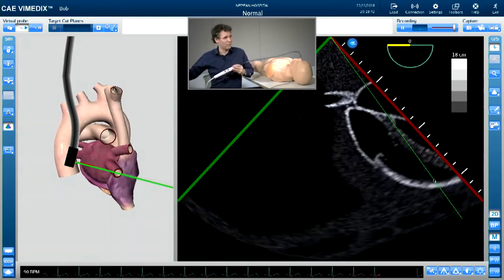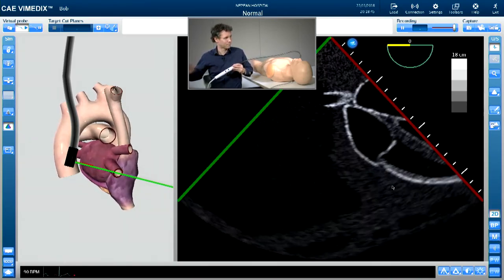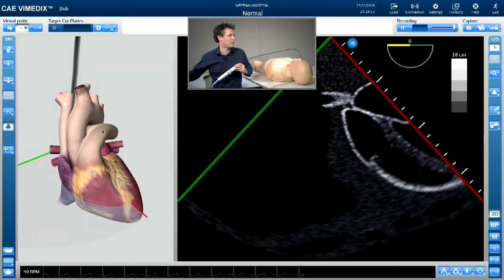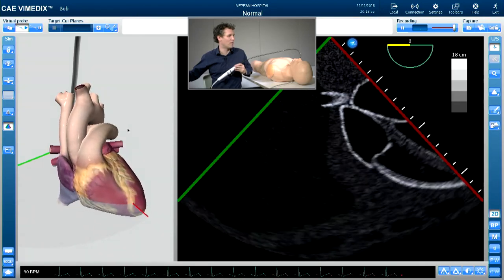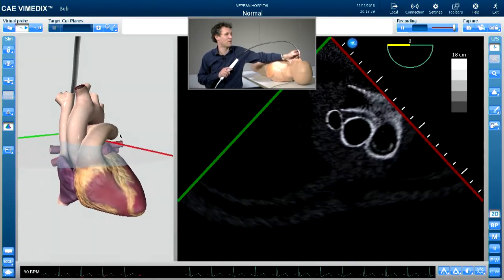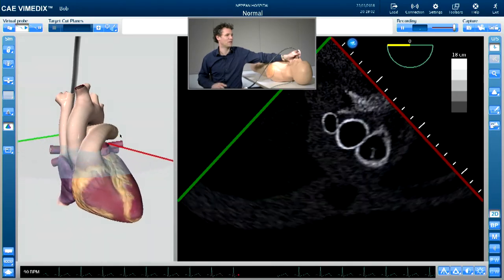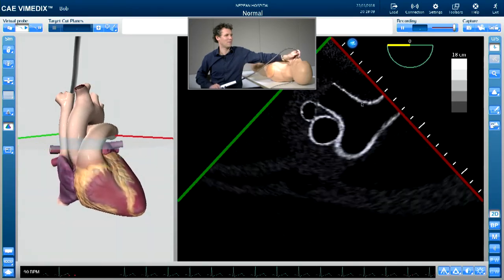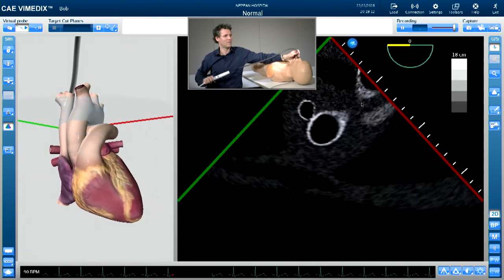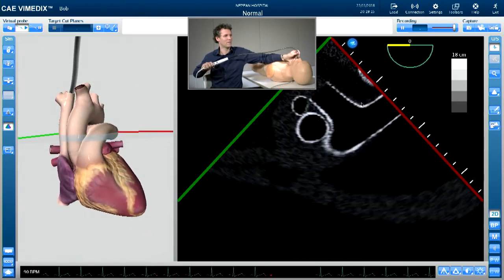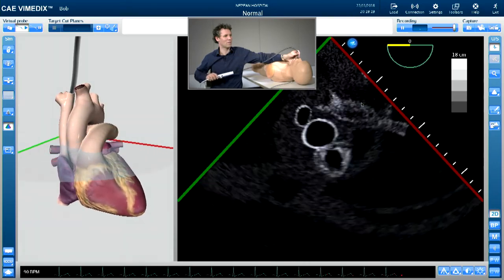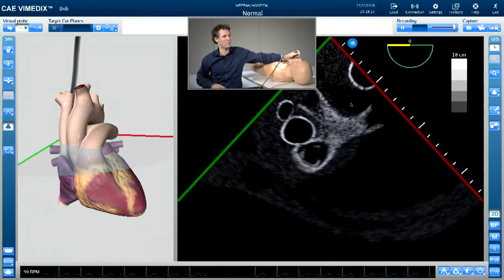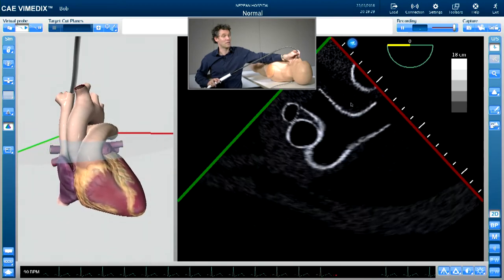You can also look at the pulmonary valve. Here's the right ventricle with the main pulmonary artery coming off, showing the right and left pulmonary arteries. Pulling up slowly, you get the junction with the pulmonary valve. This is a good place to look for saddle pulmonary emboli.